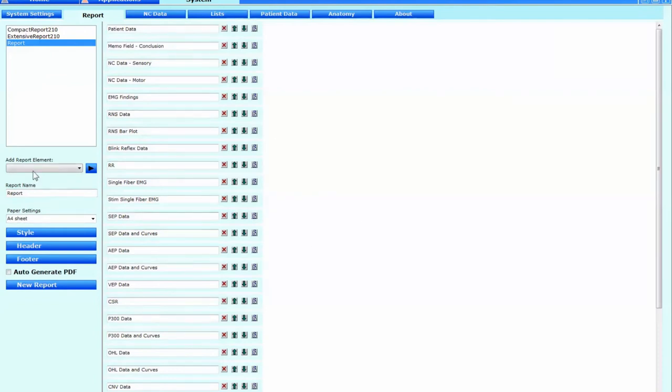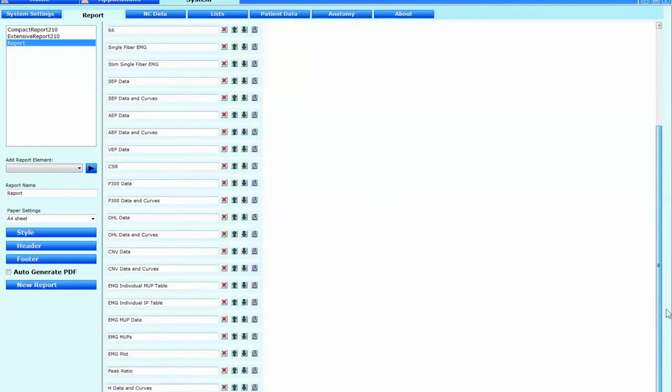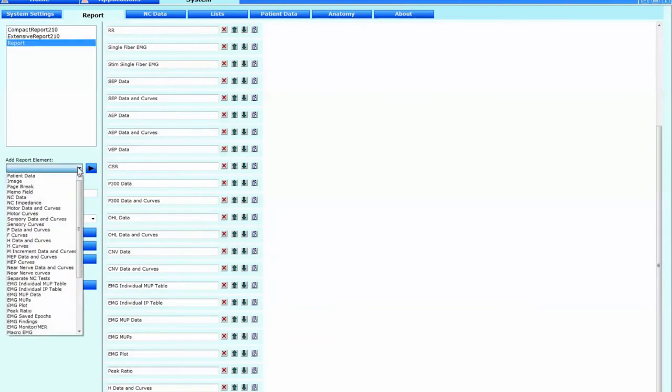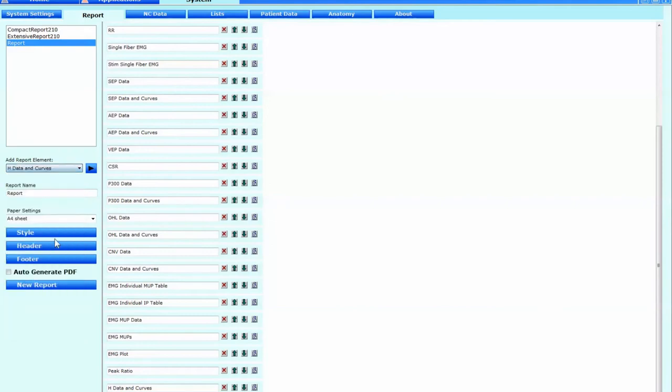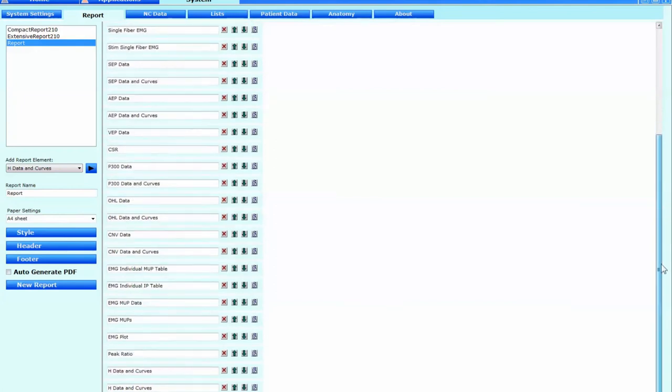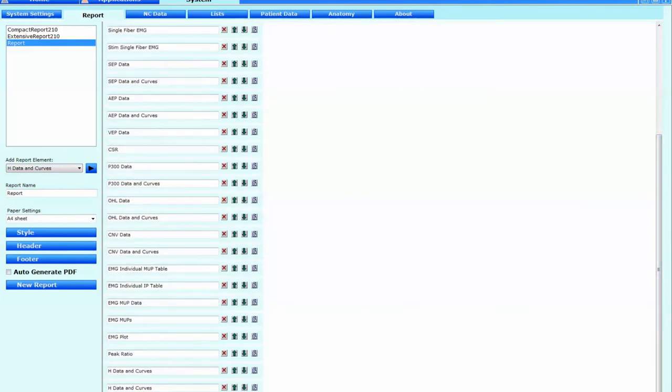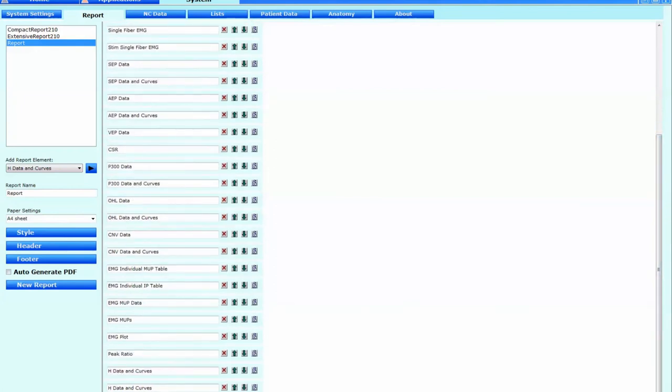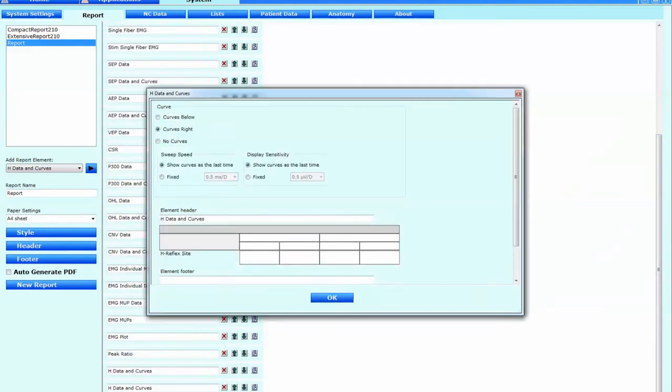In my case it's one called report. And then if you don't already have your H reflex data and curves in the list on the right then what you do is you have to add report element. And so it's on the left over here and you just go down H data and curves. Click that and then click the enter sign to the right of that and then it'll be at the bottom of the list. And you can see I've actually got this three times down there. That's from demonstration purposes for preparing this.